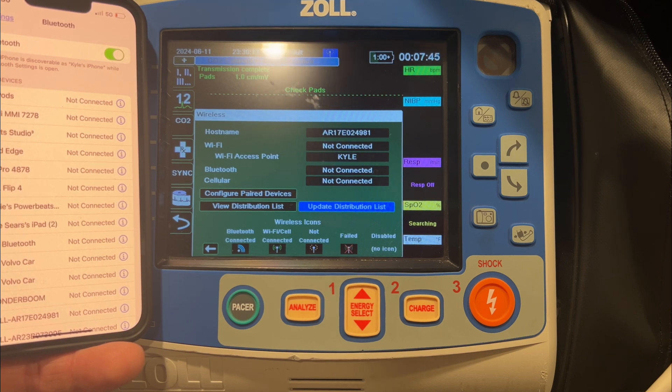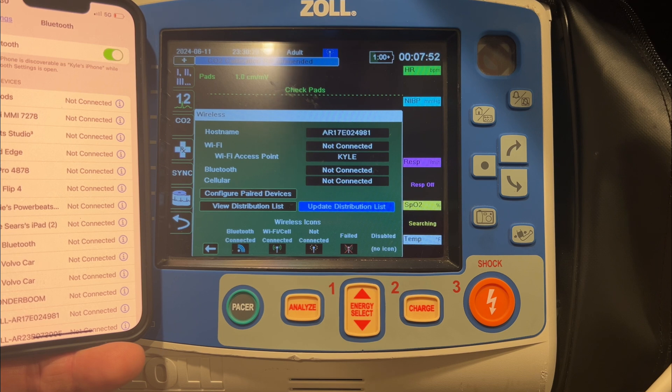The only things you need to be aware of going forward are that Bluetooth is on and that the personal hotspot is on. Neither should get turned off unless somebody physically goes in and turns those features off. This phone will now be permanently paired with this particular monitor and be able to transmit data without any additional setup. Hopefully that helps — please let me know if you have any questions. Thank you.